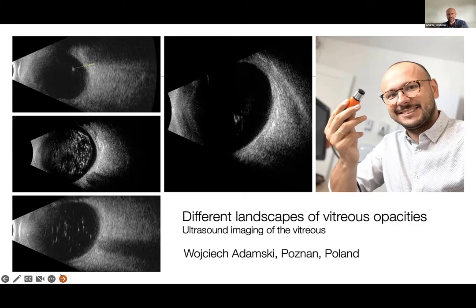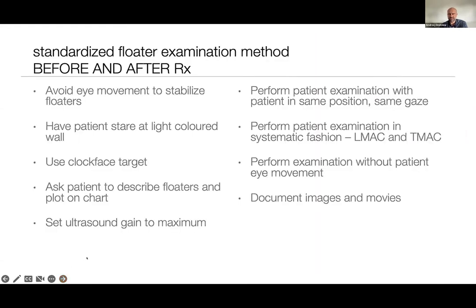Adamski would agree with me that especially when you start with YAG laser vitreolysis or similar methods which treat floaters, it is very important to understand the distances between the floater and the retina, but also the floater and the back of the lens. So in many cases, measuring those distances, especially in the beginning of your floater journey, really makes sense.